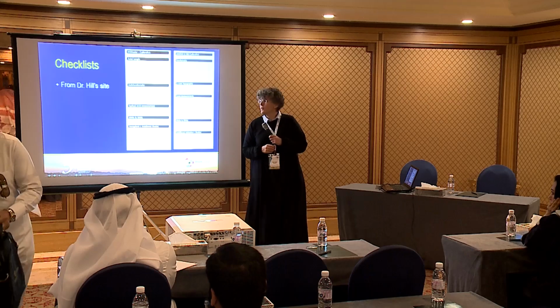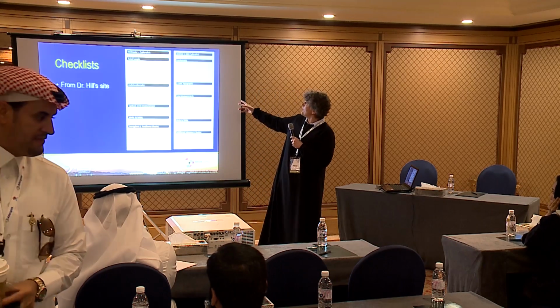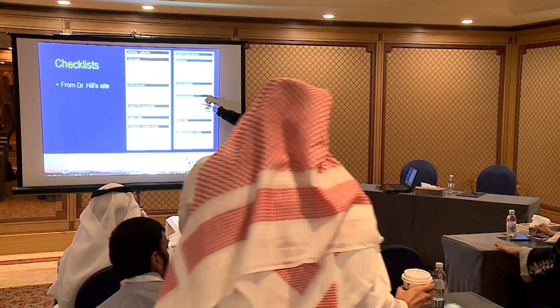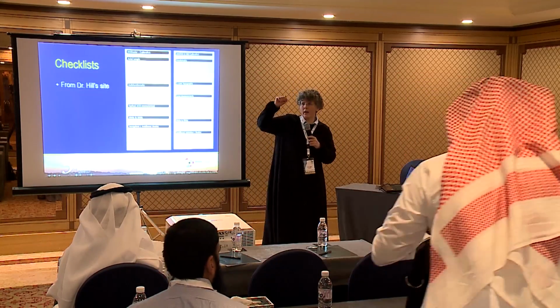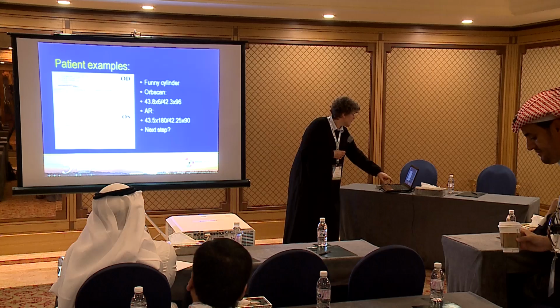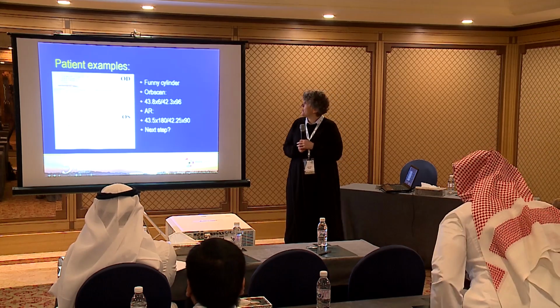Again, we have checklists, and you can just print them out from online. This is for the LENSTAR, this is for the IOLMaster. I don't know anyone who checks this off for every single patient on paper, but in your mind you should be doing it, okay? Now, I brought a couple of patient examples.